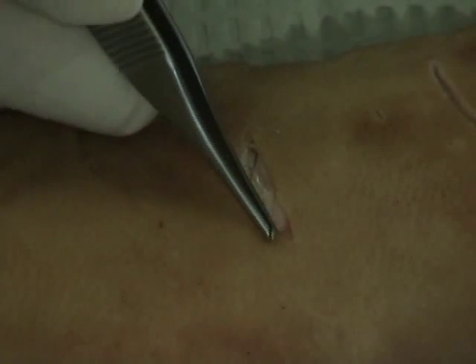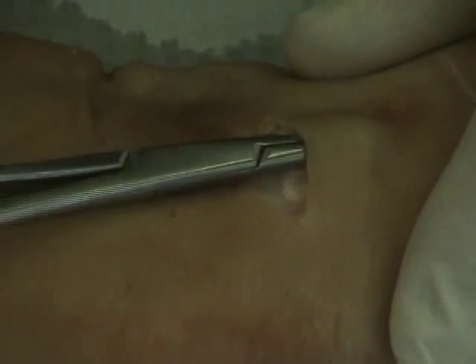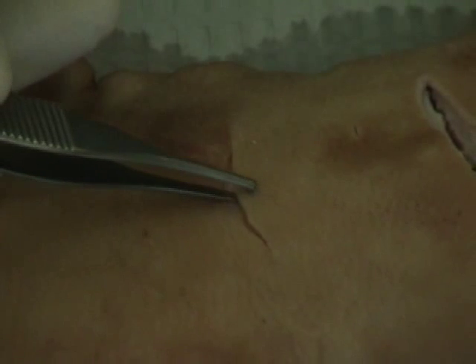Okay, so here, let's say, for example, we wish to kind of maintain this curvature as much as possible. So what I'm going to do is I'm not going to do any undermining on this side, but I'll undermine on this side so that this side will pull up more easily here and minimize the effect of flattening the curve. It's going to flatten the curve to some extent, but it will tend to minimize. At this point, the first stitch you put in is a critical stitch.